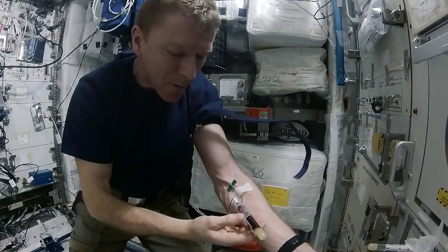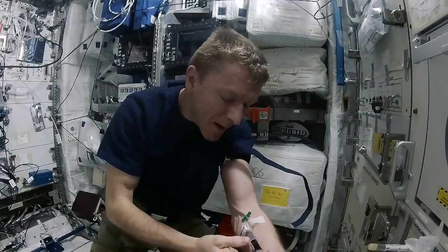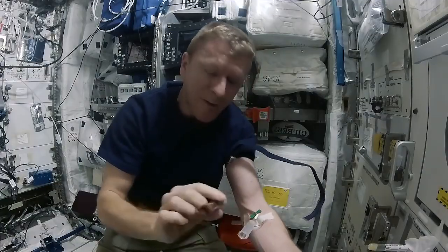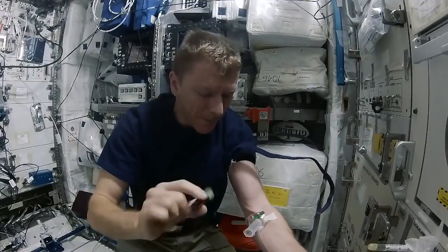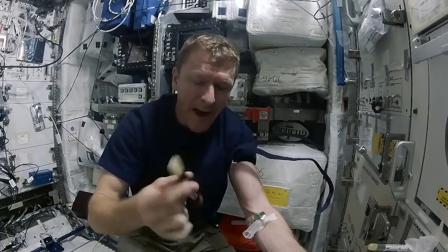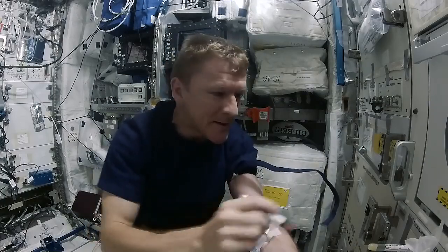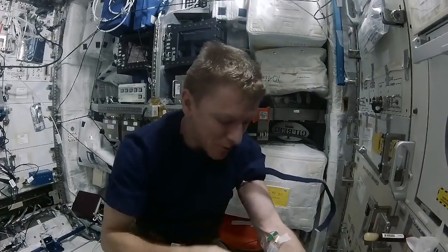Give it about 20 seconds for the tube to fill. It looks like it's filled nicely, so I remove that tube and then we just have to agitate them for about 10 seconds each tube. After 30 minutes of coagulation, these tubes will go into a refrigerated centrifuge. Second tube.